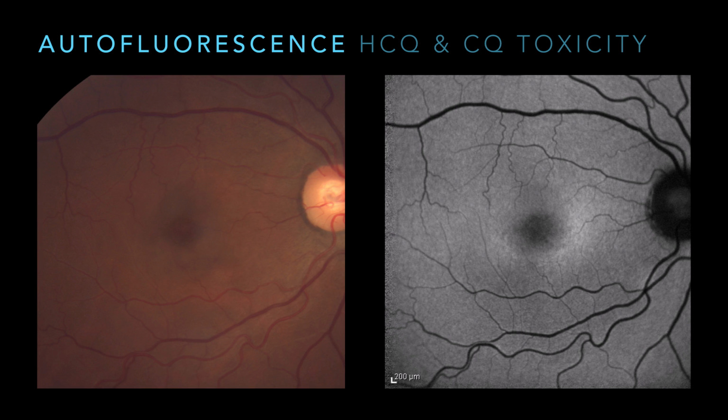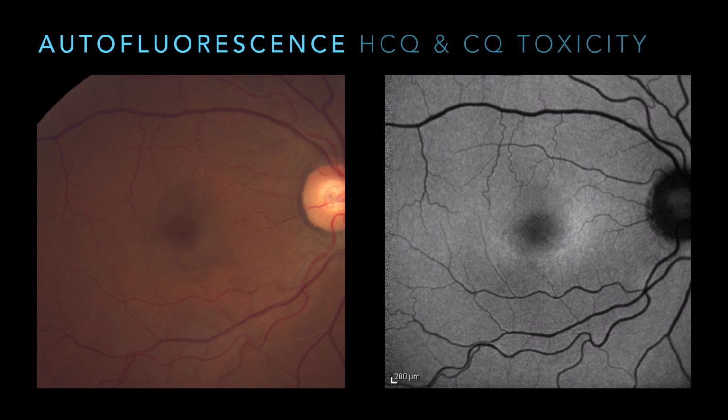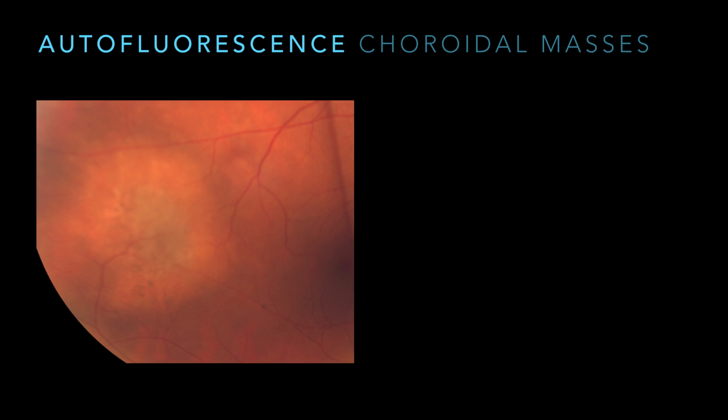Another patient with chloroquine, hydroxychloroquine history, very non-compliant in her follow-up, and you can see from her autofluorescence, sorry about that, she's got a little bullseye maculopathy there, and she did finally stop her medication.